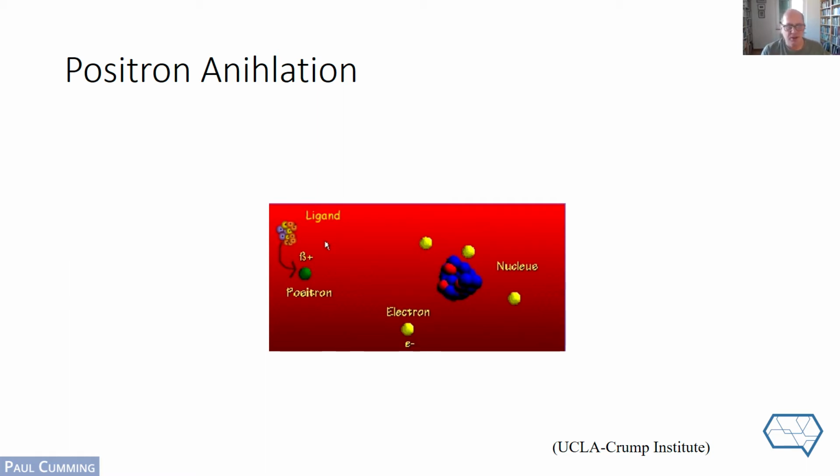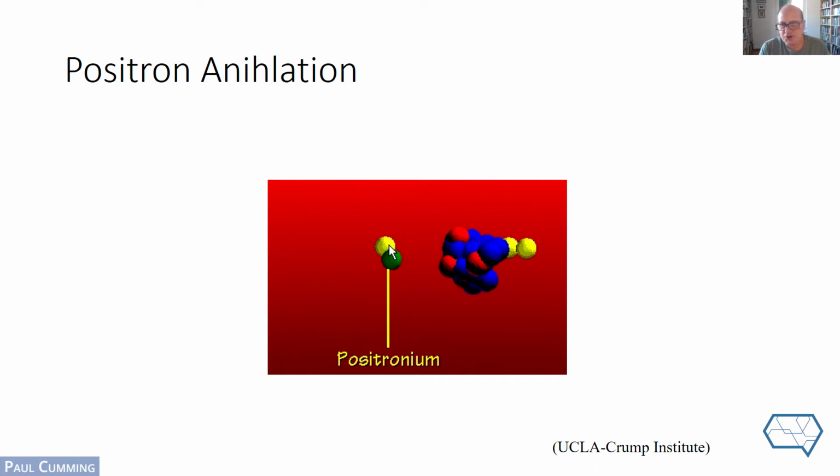half-life of 2 hours, randomly releasing an antimatter electron known as a positron, beta plus, which floats around in the medium of the brain, or rather it travels with some high energy. Next, forward. And it then encounters the electron in the medium of the brain, positive and negative charges being the only difference between the positron and the electron, but they are attracted to each other electrostatically. Next slide. And they merge together in this fatal attraction as a short-lived element, let's say, called positronium.